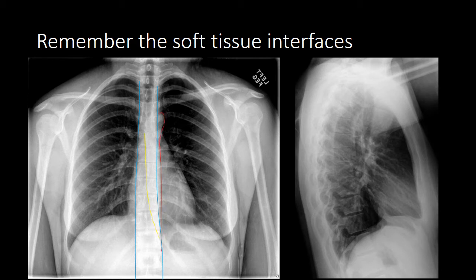To quickly review those interfaces: we have the azygous esophageal recess, the paraspinal lines, the descending aorta, the heart borders, the right paratracheal line, the pleural surfaces, and the hemidiaphragms. On the lateral radiograph, we can see the posterior wall of the trachea, the right and left bronchi, the right and left pulmonary arteries, the heart border, the pleural surface, and the hemidiaphragms. Continually looking at each of these lines on every radiograph will help you identify subtle abnormalities and localize where those abnormalities are.